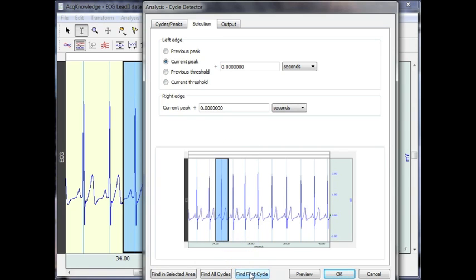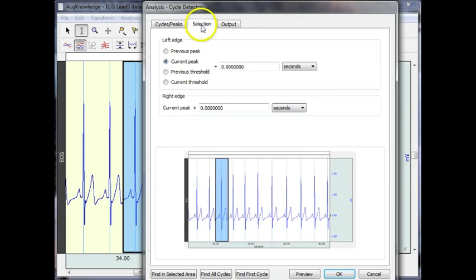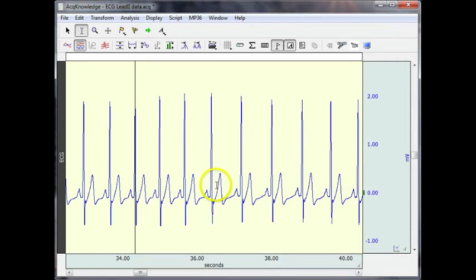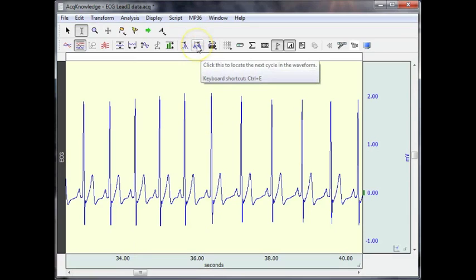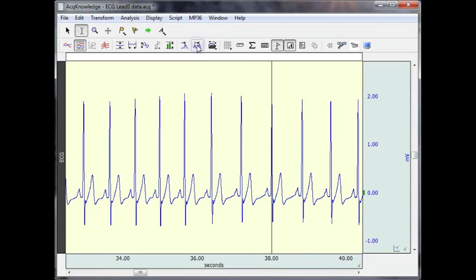I can ask the software to find this first cycle. So now we can see a cursor blinking over the top of the first peak that we found. And I can ask the software to advance through so you can see the cursor jumping from one R-wave to the next.